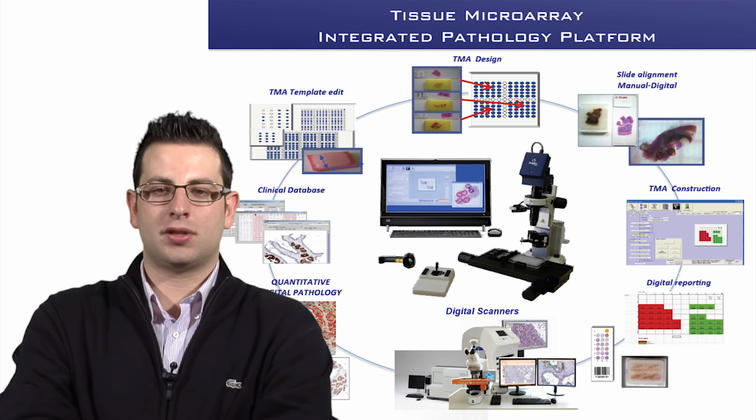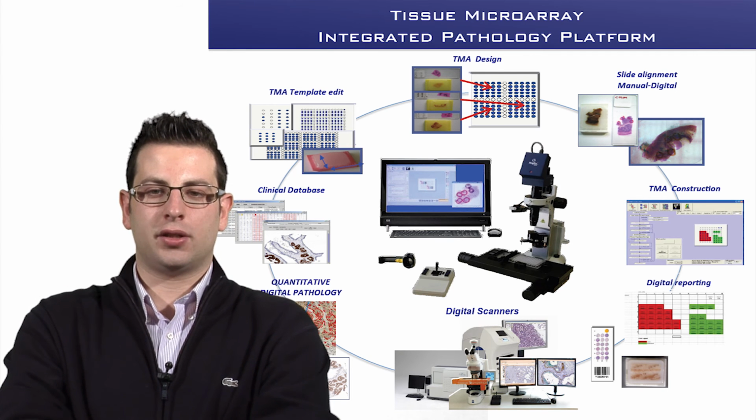The Galileo TMA was designed to be used for research project and diagnostic application, where full traceability is a must.